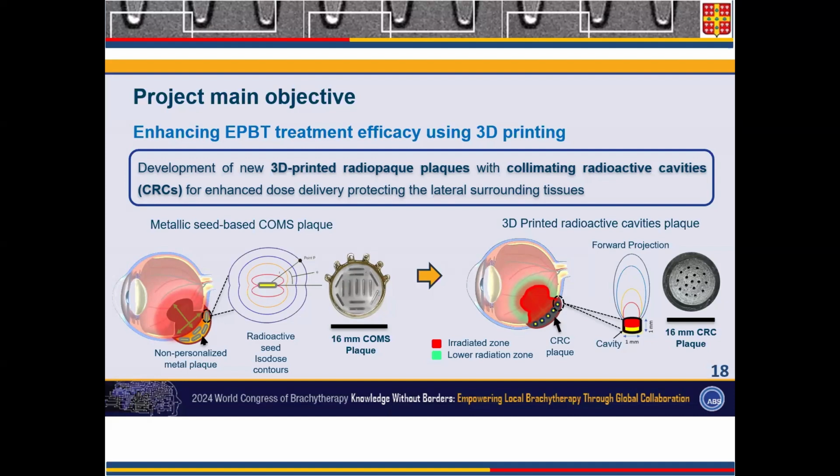And a brachytherapy device must shield the radiation at least in one direction. For instance, when you place an episcleral plaque at the surface of the eye, you don't want your eyelid to be completely cooked by the radiation. You really want the radiation to be projected towards the inner side of the eye where the tumor is. So you want to block the radiation. By using a polymer that doesn't block radiation, you lose a very significant function of the traditional plaque.